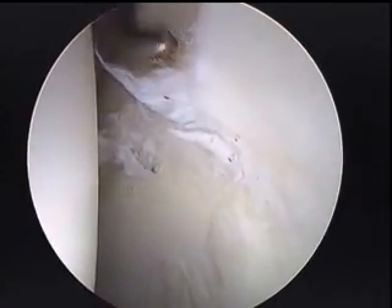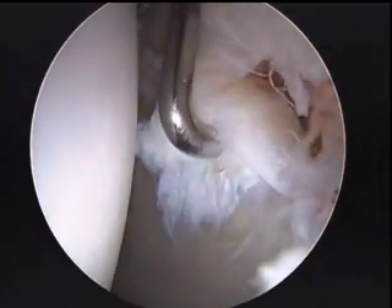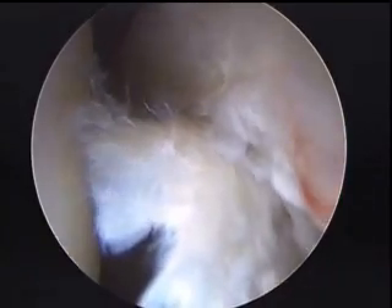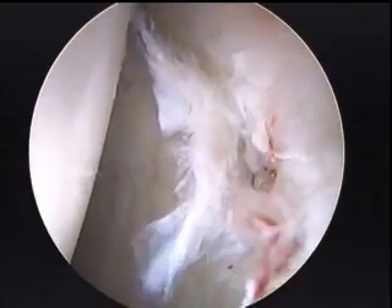This is the initial hip arthroscopy looking inside his hip. The femoral head is on the left and on the right we're looking at significant labral tearing. Flipping back of that is cartilage delamination coming off of the acetabulum, or the hip socket. This is quite significant pathology seen inside the hip, and it does explain his pain throughout the front of his hip.